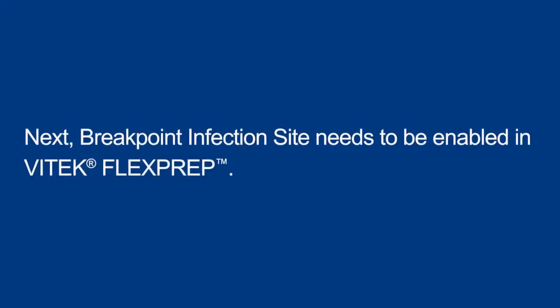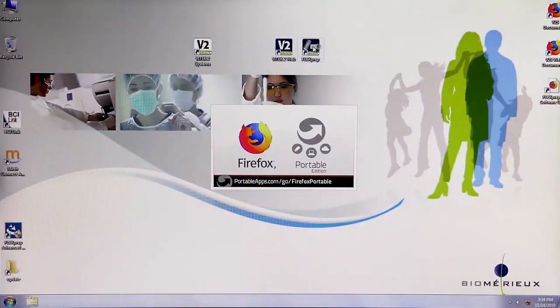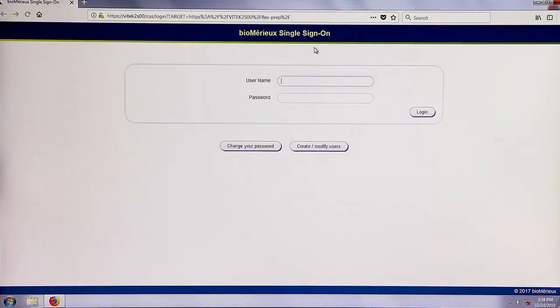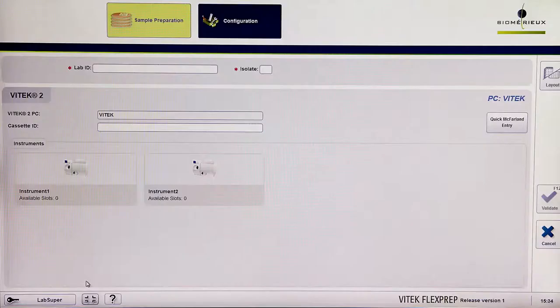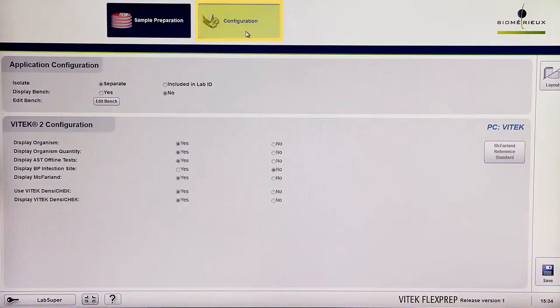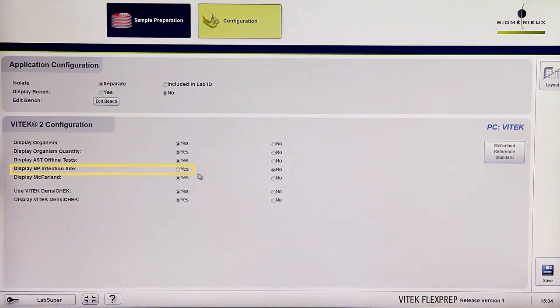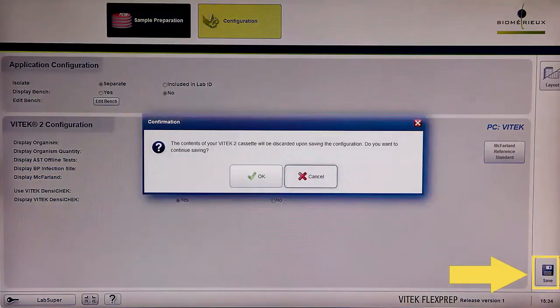Next, breakpoint infection site needs to be enabled in Vitec FlexPrep. Log in to Vitec FlexPrep as a user with supervisor level access. Click on the configuration icon to view Vitec FlexPrep configurations. Click the radio button next to yes for display BP infection site, then save the configuration change.